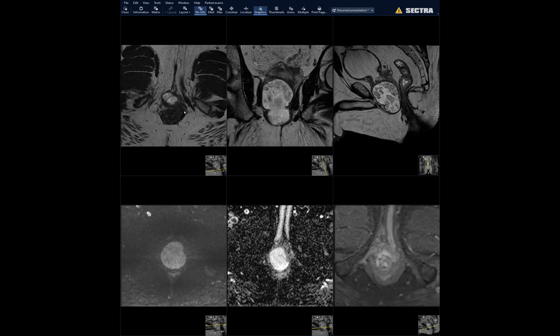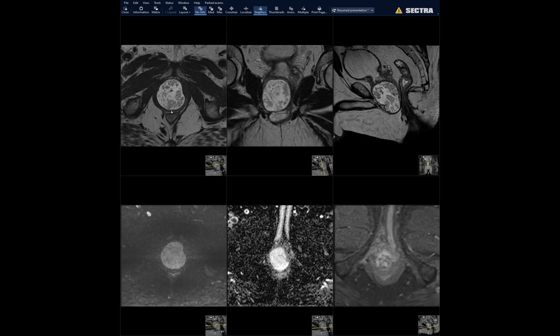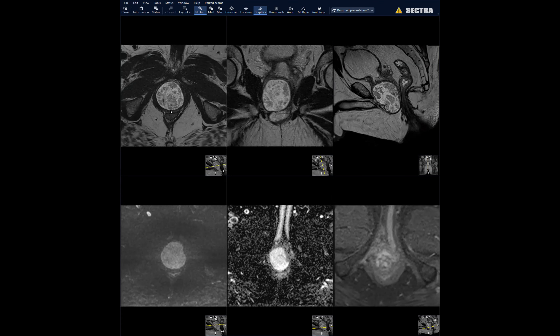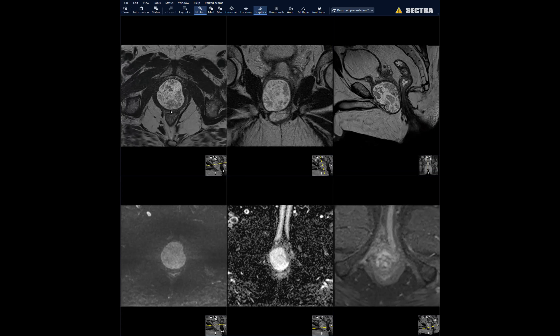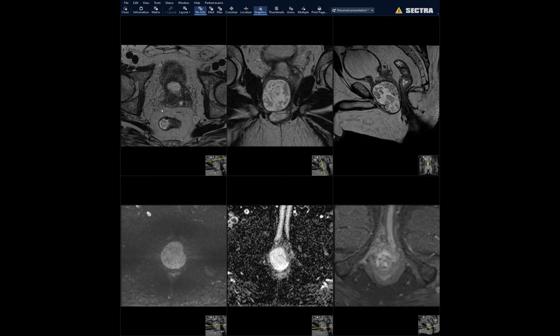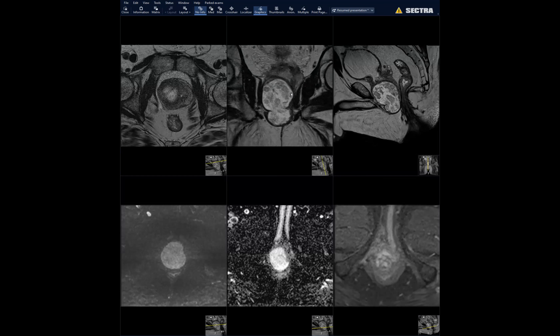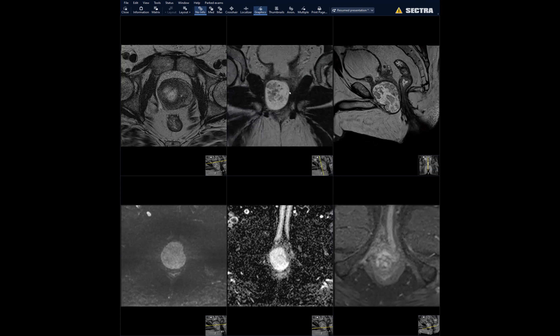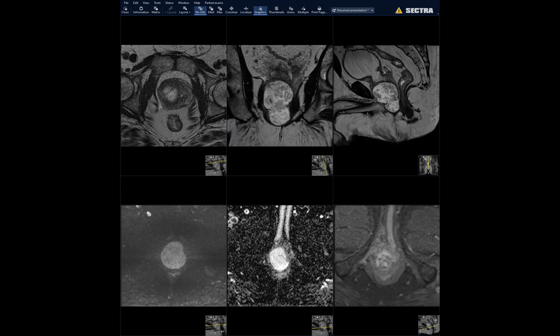The mass looks slightly eccentric within the gland — it's unclear if it's truly within the gland or just pushing the capsule to the side. On biopsy, this turned out to be mesonephric remnant hyperplasia. This was something not previously encountered; searching revealed it is heavily described in the pathology literature, but no radiology case describing it could be found. In pathology, mesonephric remnant hyperplasia is described as a benign mimic of prostatic adenocarcinoma — it looks similar on pathology but appears completely different from classic adenocarcinoma on imaging.